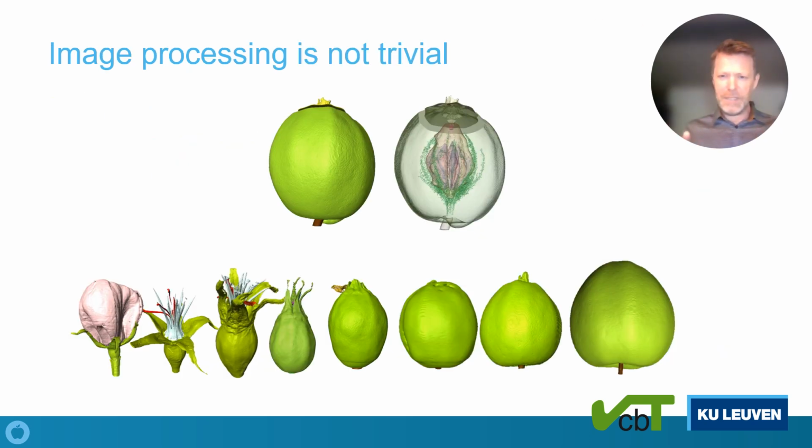So X-ray images as such are just kind of boring grayscale images, where the intensity of a pixel in the image tells you something about the difference in absorption with respect to the neighboring pixels. So we need to still process these images if we want to understand better how they reflect the actual internal structures.